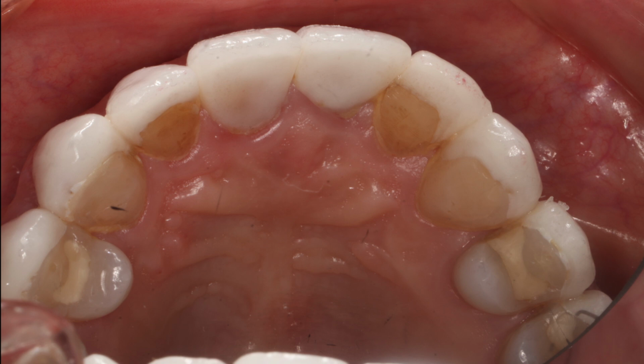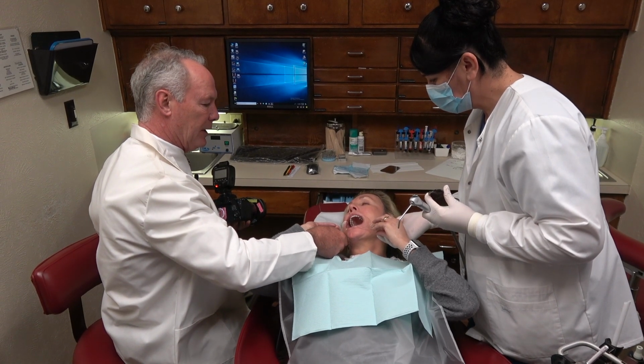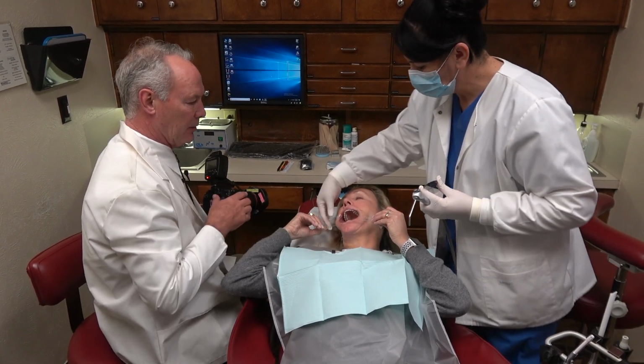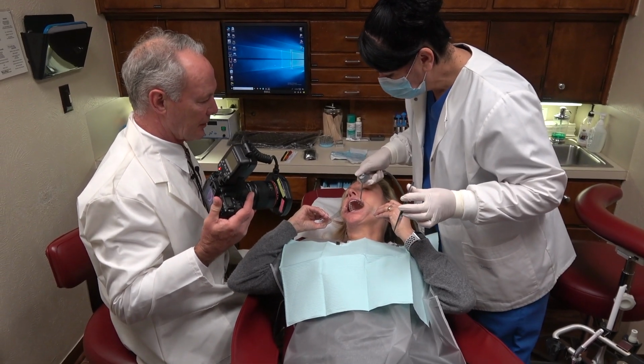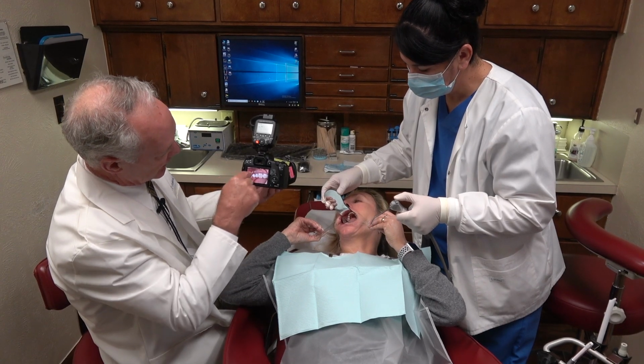And this shows worn incisal edges. Okay, now down, and you want the patient to hold these down and out as far as they can. Blow a little air on the occlusal surface of those teeth, please, Lisa. Good. See, straight on.